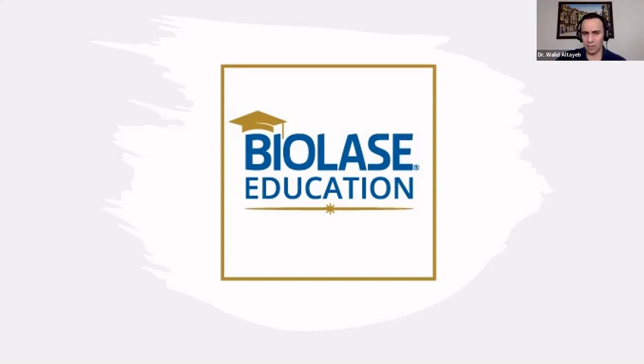There are a couple of questions I can answer very fast. One question was about follow-up with erbium, and our research was for follow-up for 2 years. Right, so this is this one. And about how to use it with a localized area with very deep melanin pigmentation. Mostly we are dealing here with non-physiologic pigmentation, hyperpigmentation, sometimes staining coming from metal restoration, et cetera.